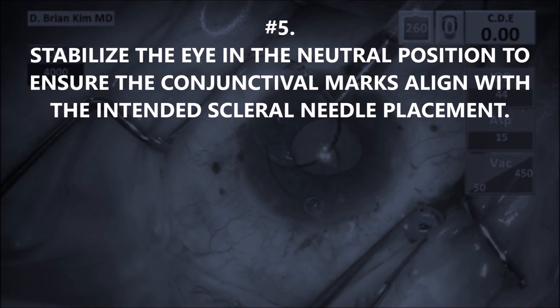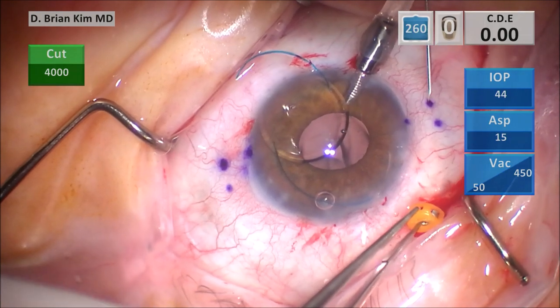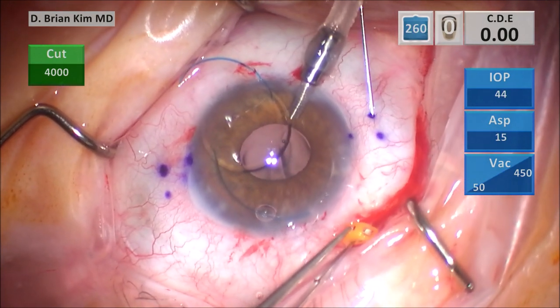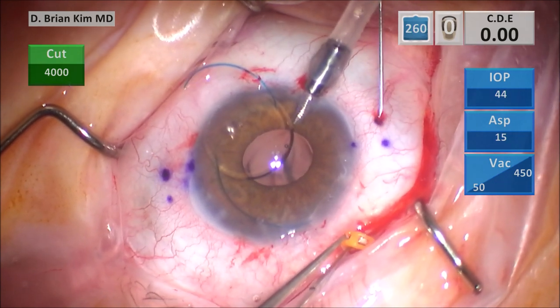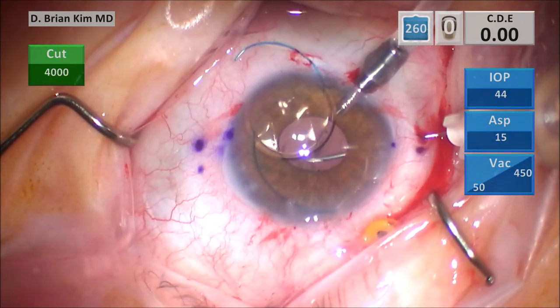Number five: you want to stabilize the eye in the neutral position to ensure the conjunctival marks align with the intended scleral needle placement. In the past, I wasn't aware of the conjunctival marks being mobile because the conjunctiva is loose tissue — as you're manipulating it, it'll start to distort and move. So your intended marks are not necessarily where they were; you want it to be two and a half millimeters posterior and two millimeters adjacent. Because the tissue can stretch and move, it might not reflect that. So it's important to hold the eye in the neutral position. I'm using 0.12 forceps holding the trocar, holding the eye in the neutral position, and I'm stabbing the first mark with the needle — entering and tunneling two millimeters, then diving in. You want to make sure the needle is in the pupillary zone.